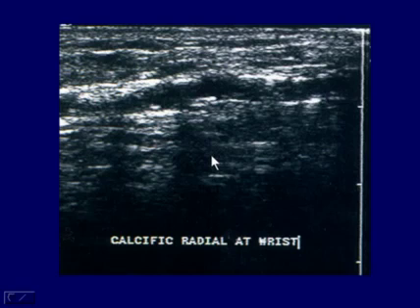But if we have any doubt, what we'd want to do is take this vessel, go into a transverse scan, and then slightly compress with the transducer such that we can see whether or not it's compliant. Maybe there's some intermittent calcification, maybe there's just some intermittent wall thickening, but if we can compress that artery with ultrasound probe pressure, then it's still a compliant vessel and we're okay.